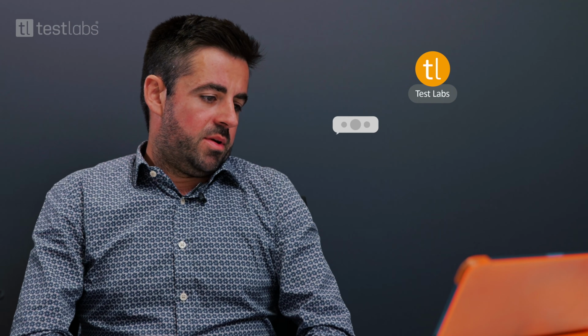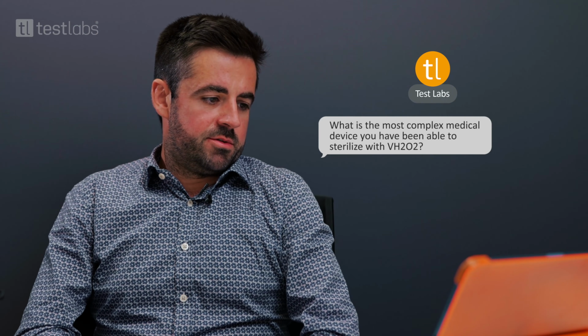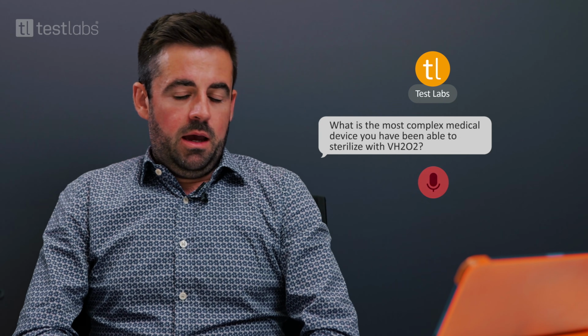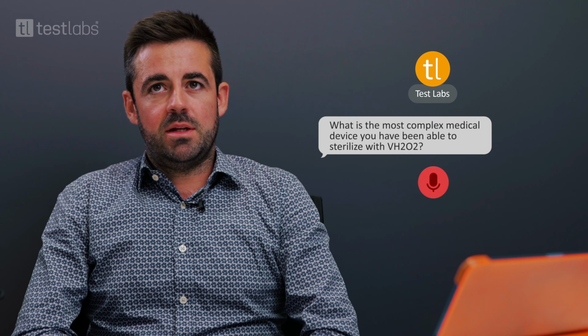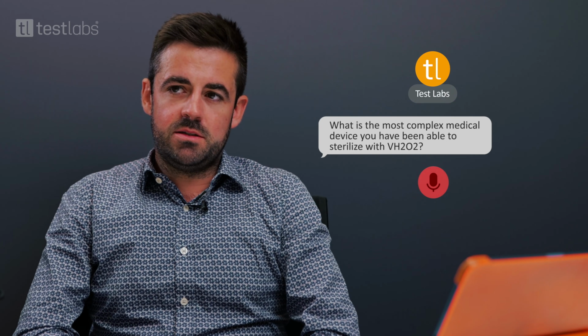What is the most complex medical device that you have been able to sterilize with VH2O2? Actually, there is not one single medical device. There are, let's say, 2 or 3 different cases. 2 of them are made of a polymer which was in theory incompatible.